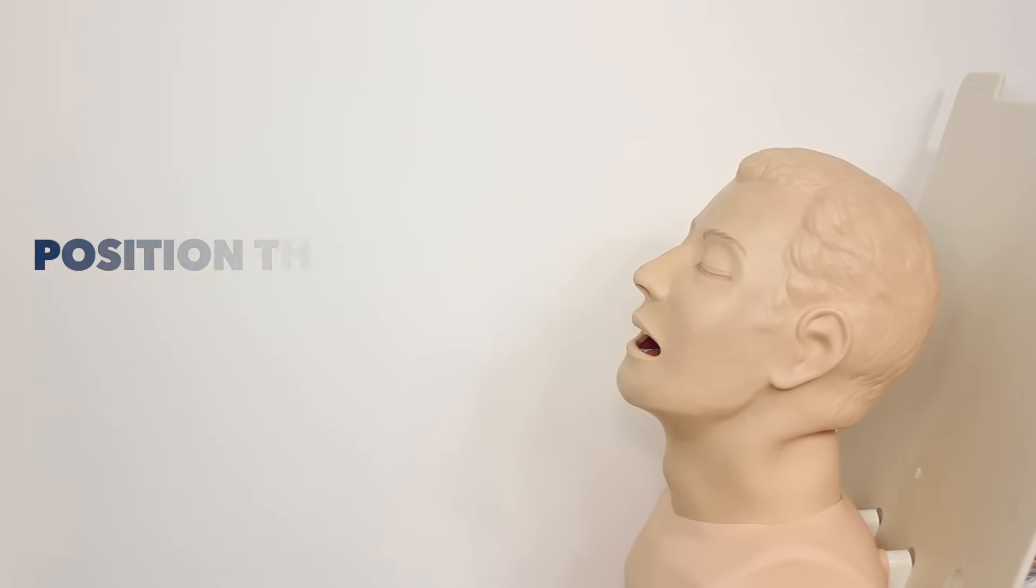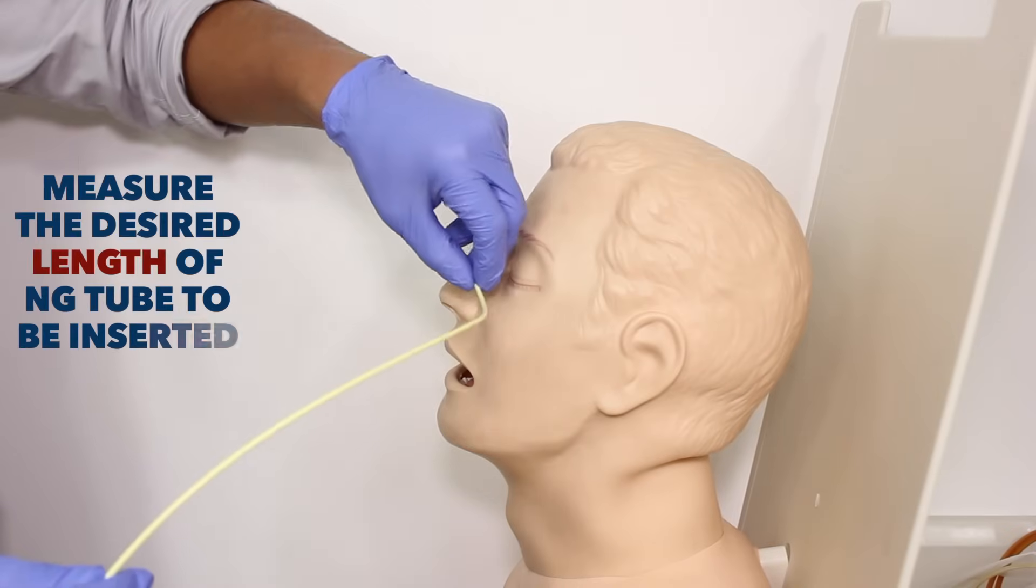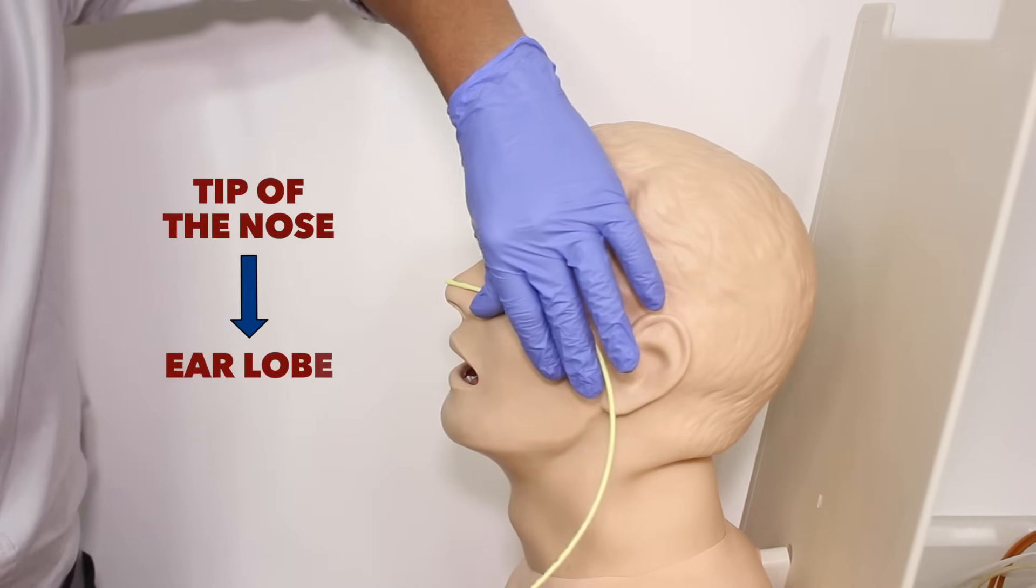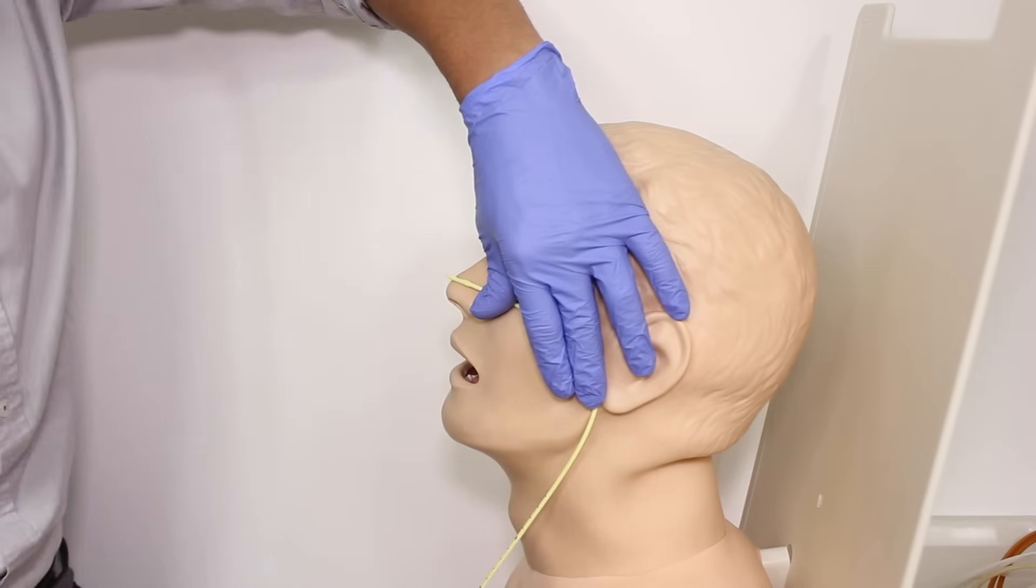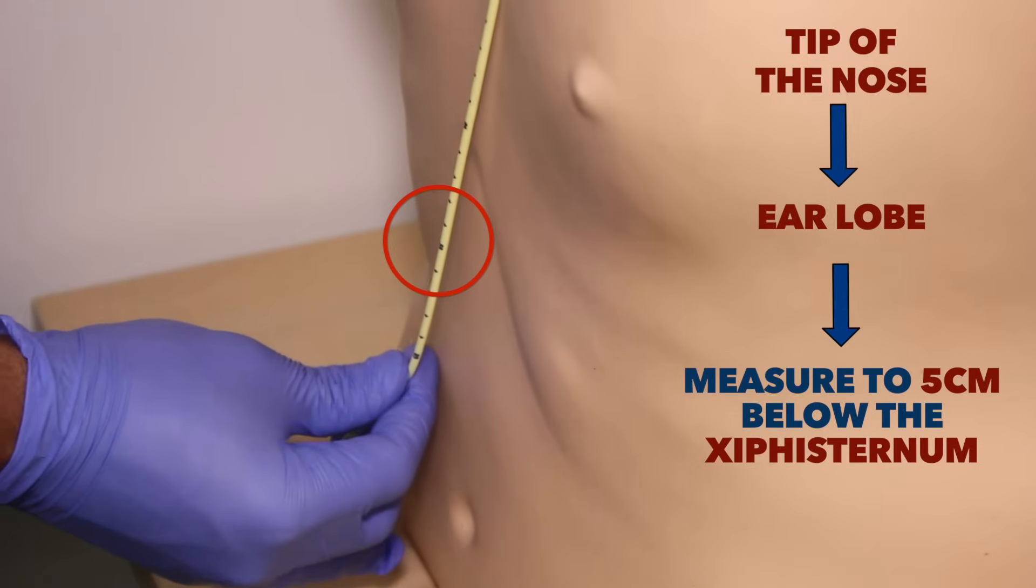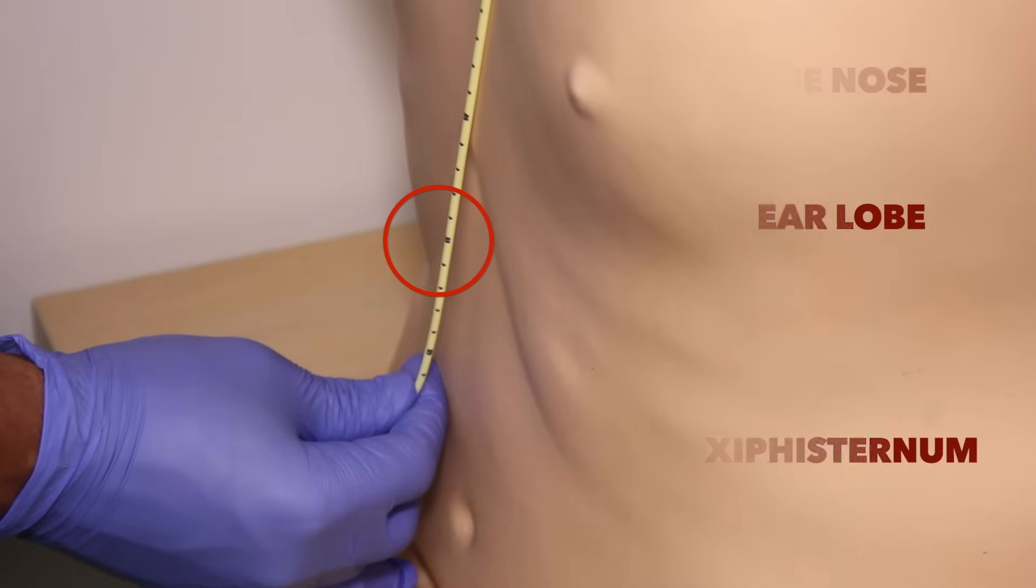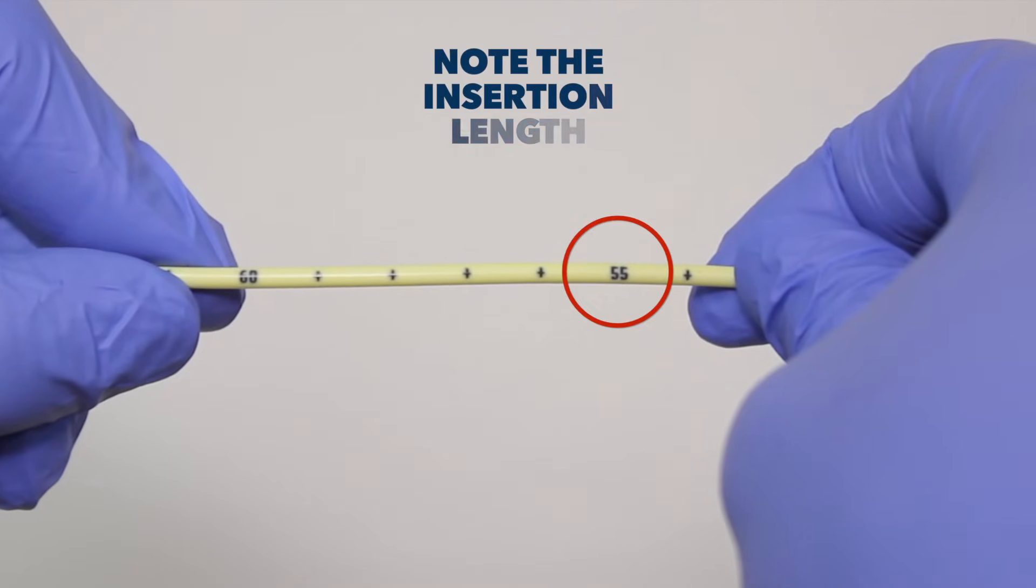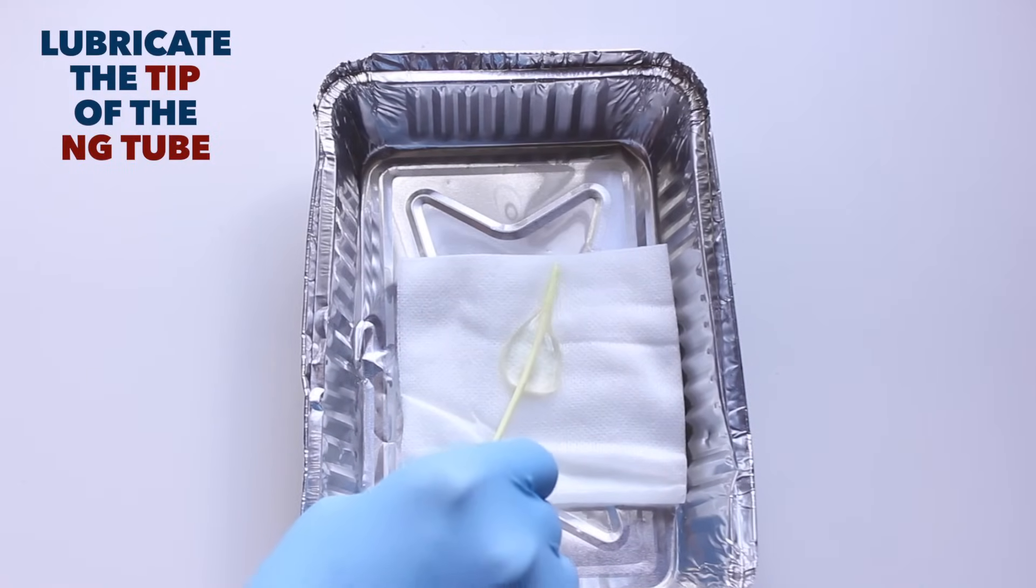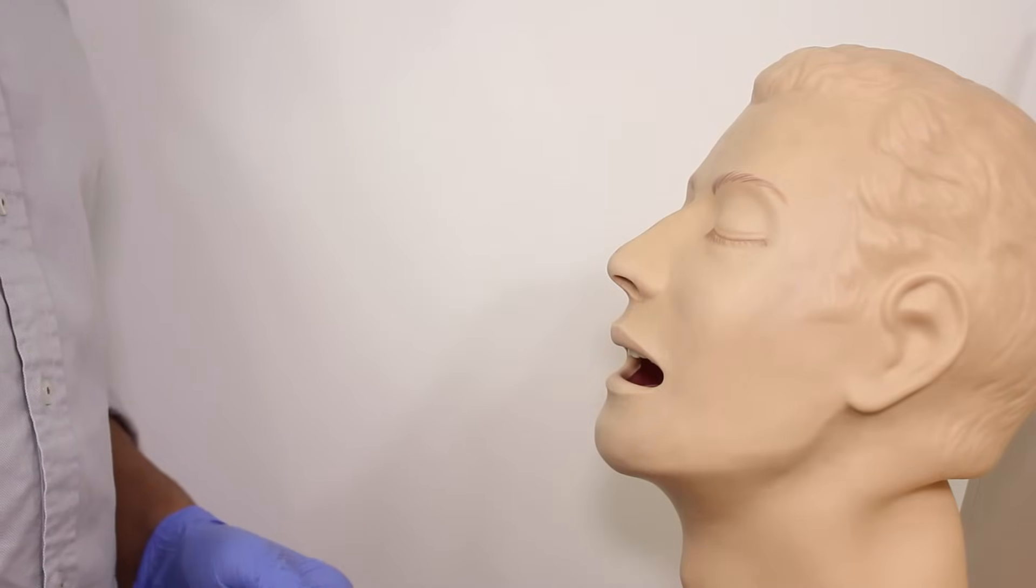Thank you. I'm going to put the tube in now. It's going to be a bit uncomfortable. If you could take small sips of water while I'm advancing the tube, and tap me on the arm if it gets too uncomfortable.